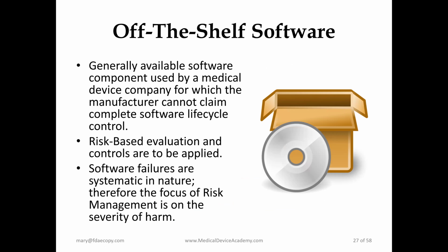Off-the-shelf software in the context of medical devices is a generally available software component that's used by a medical device company for which the manufacturer cannot claim complete software lifecycle control. For a lot of companies, this might be an operating system if you're running on Windows. We'll get into some more specific examples in a minute, but a lot of times software in medical devices contains some element of OTS software. So this is an important area that the FDA is focusing on now.